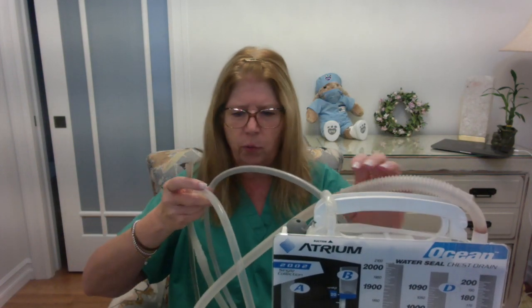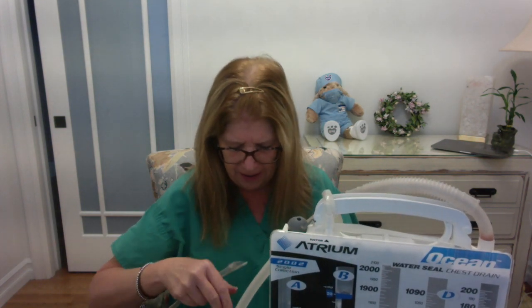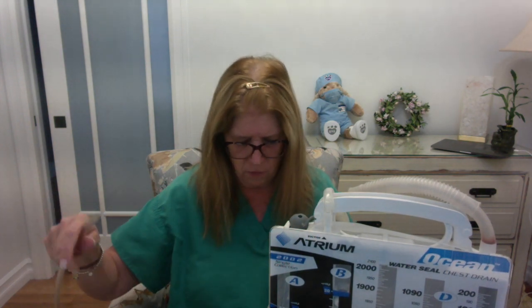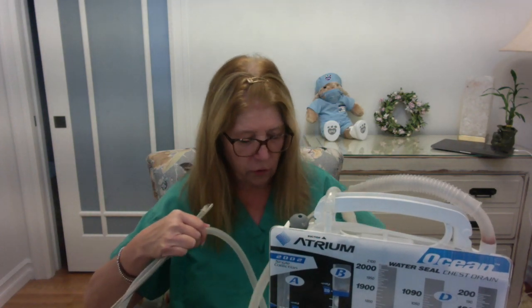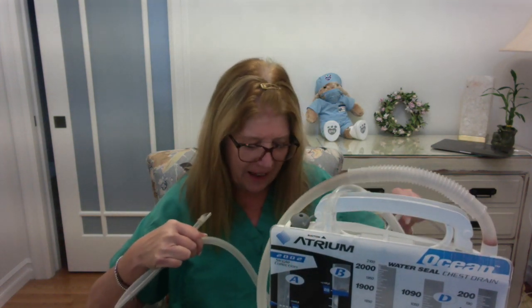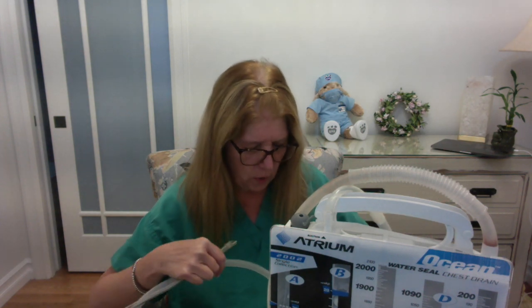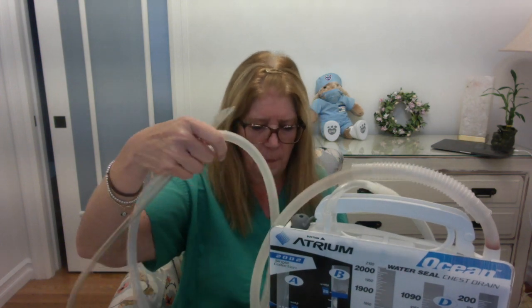So first and foremost, we do have a lot of tubing here. So let me sort of try to detangle some of this tubing so that we can kind of get a better idea of what we're talking about here. So we're going to have basically two sets of tubing. We're going to have one set of tubing that is going to be connected to the actual chest tube that's in the patient's chest. And then we are going to have some tubing that is going to get hooked up to suction if suction is indeed ordered for this particular patient.